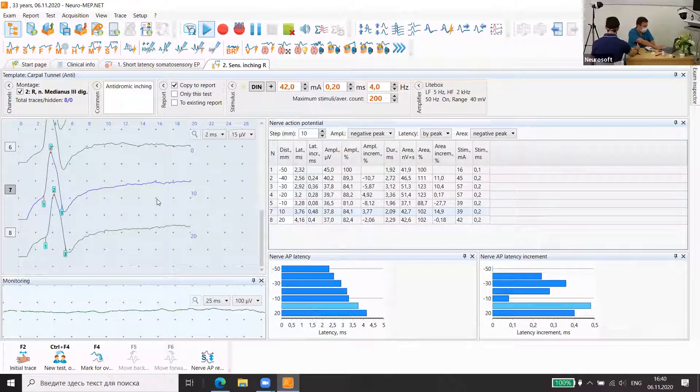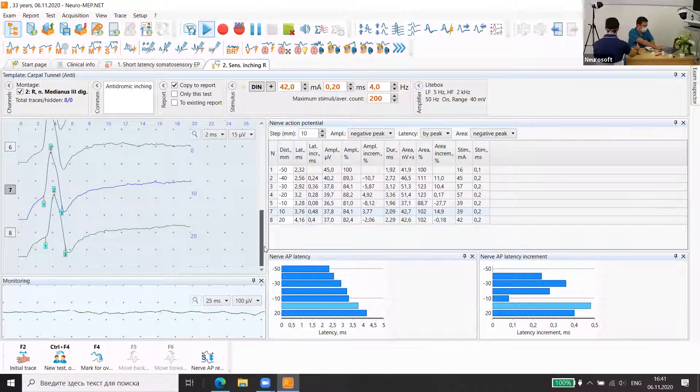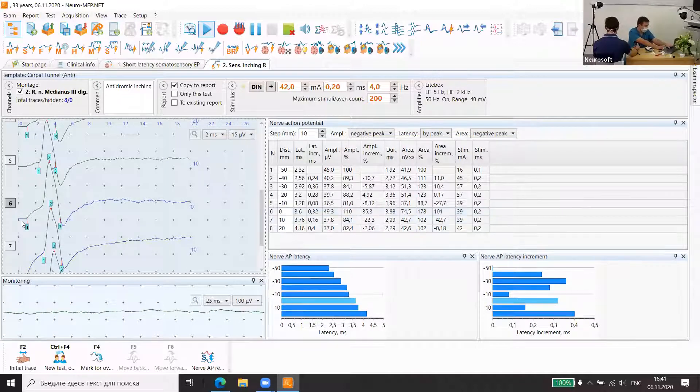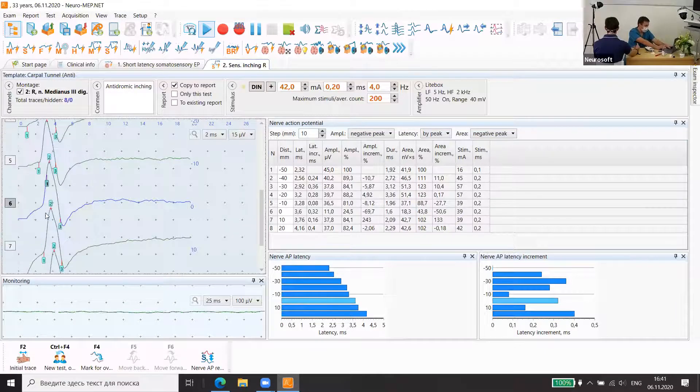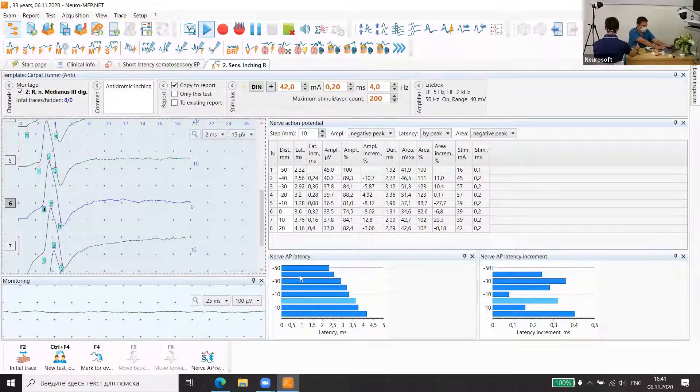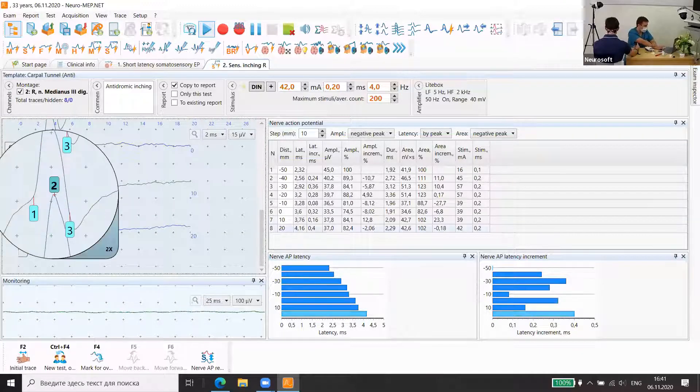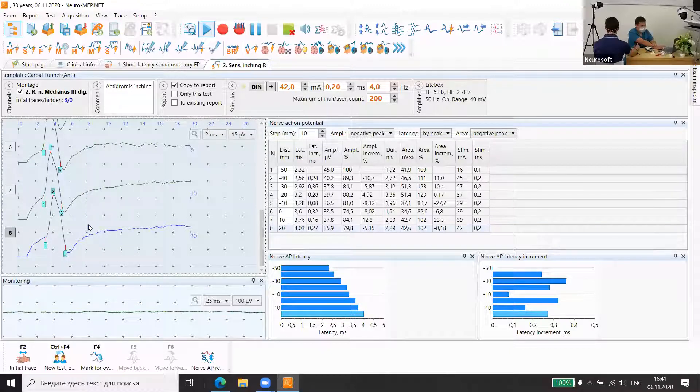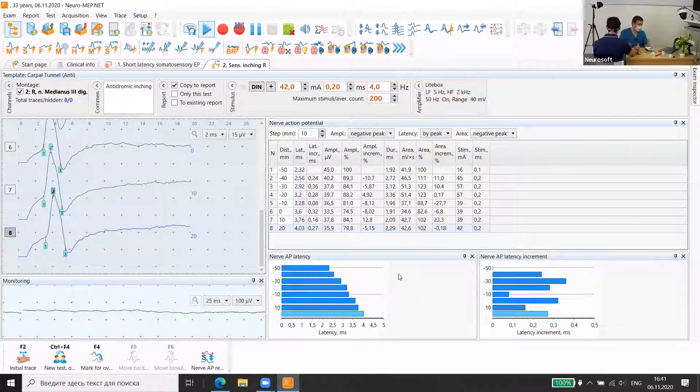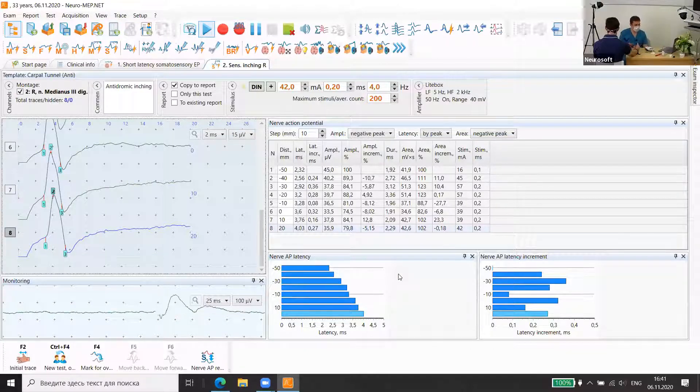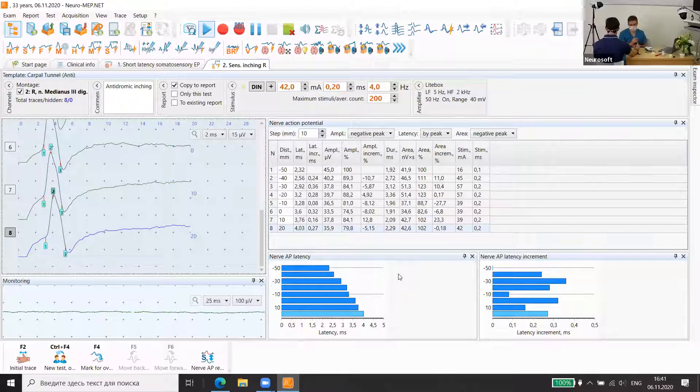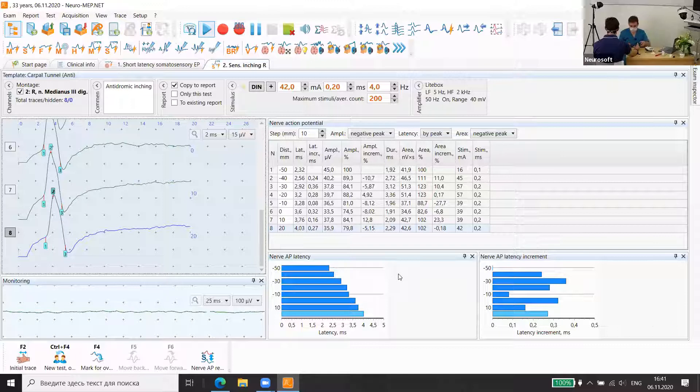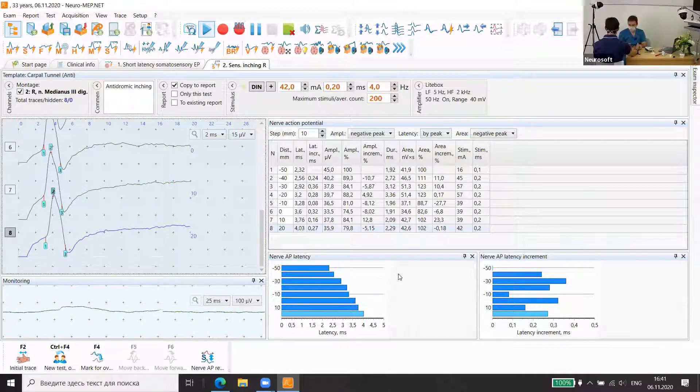Please see on the sixth trace, there is no response. Please mark it. We can set it with alt. Up to 0.4 milliseconds, it's absolutely normal. Usually if we have increasing more than 0.4, sometimes up to one millisecond in one centimeter distance, it's a problem. We call it a localized problem. Now it's okay. So that was sensory inching.